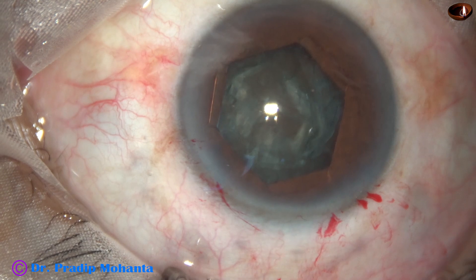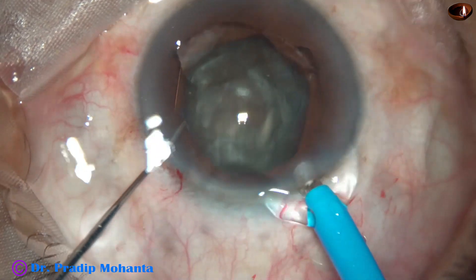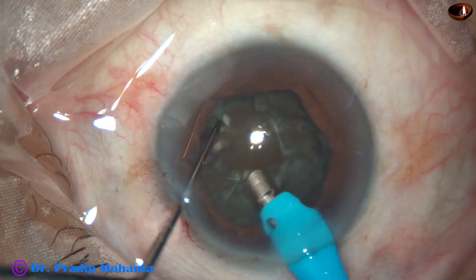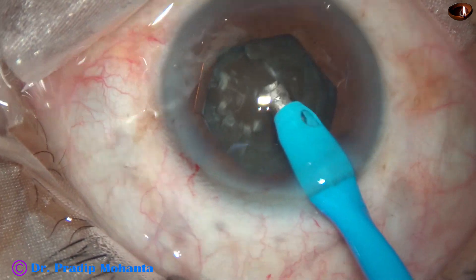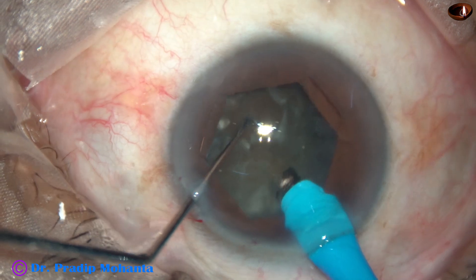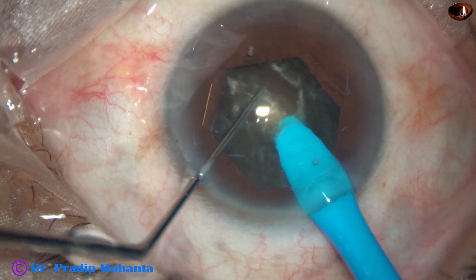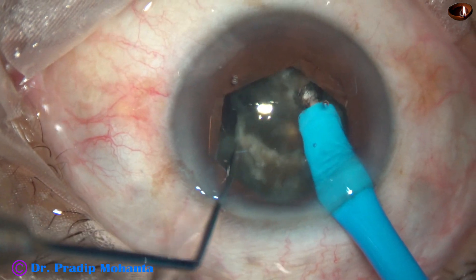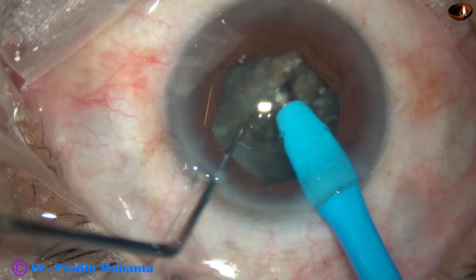Now I am going to use my technique, the submarine chop, for dividing this nucleus into pieces. Some superficial cortical lens matter is removed. The phaco tip is turned to make the bevel up, that is, towards the cornea, and the tip is buried just in front of the main incision. It goes through the substance of the nucleus towards the opposite equator, and as it reaches the opposite equator, the chopper is used to get a nice crack.